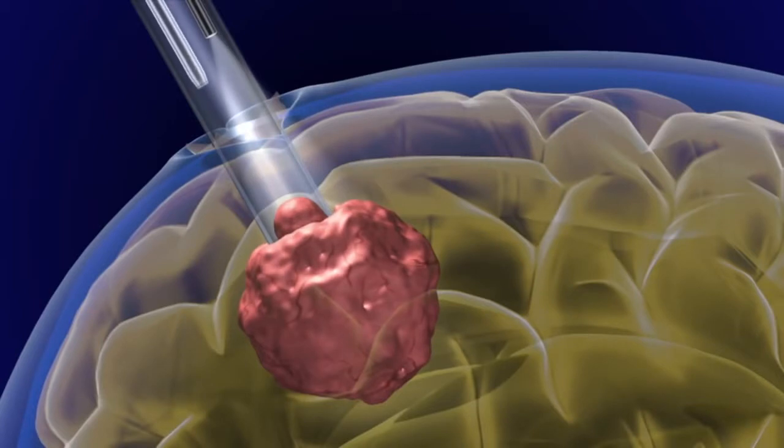A small endoscope is then inserted into the port, allowing the neurosurgeon to see the tumor and its surrounding structures in high definition.